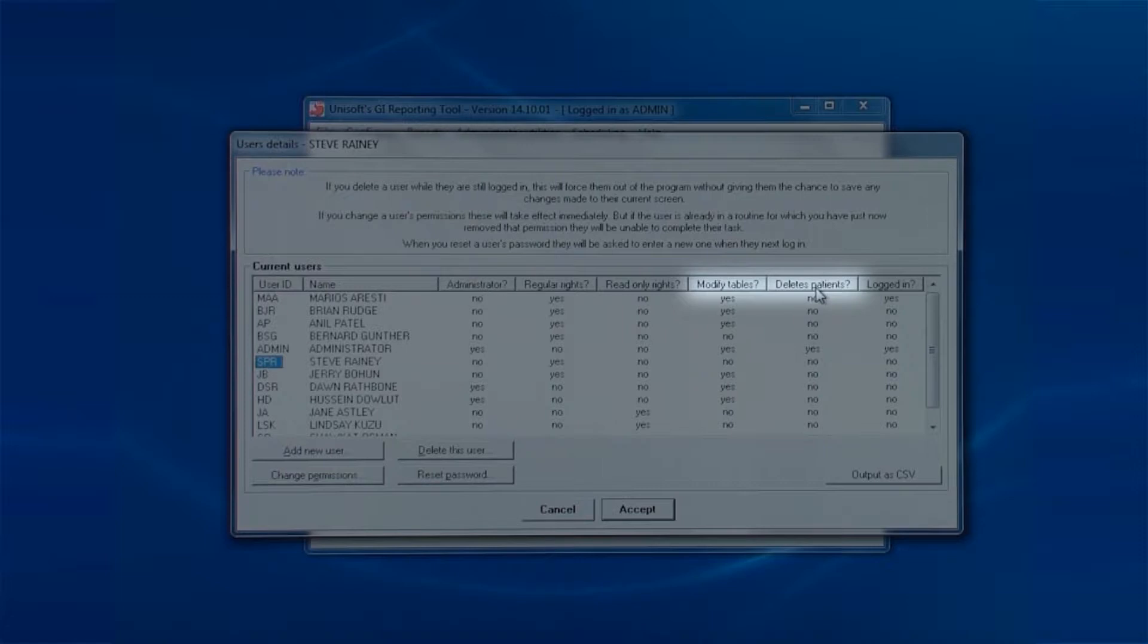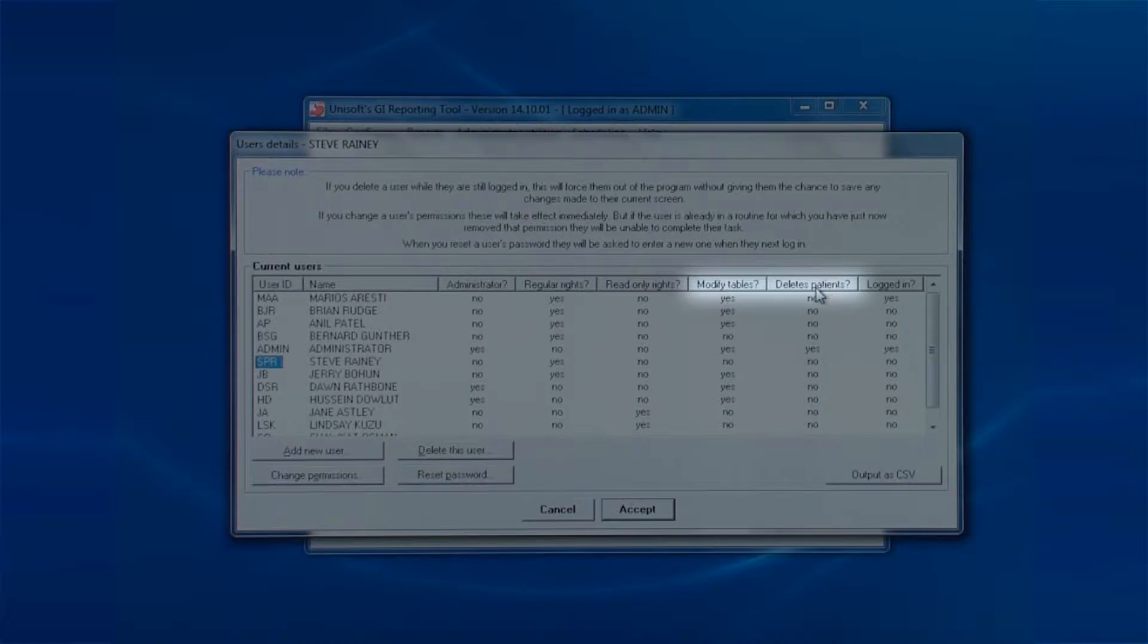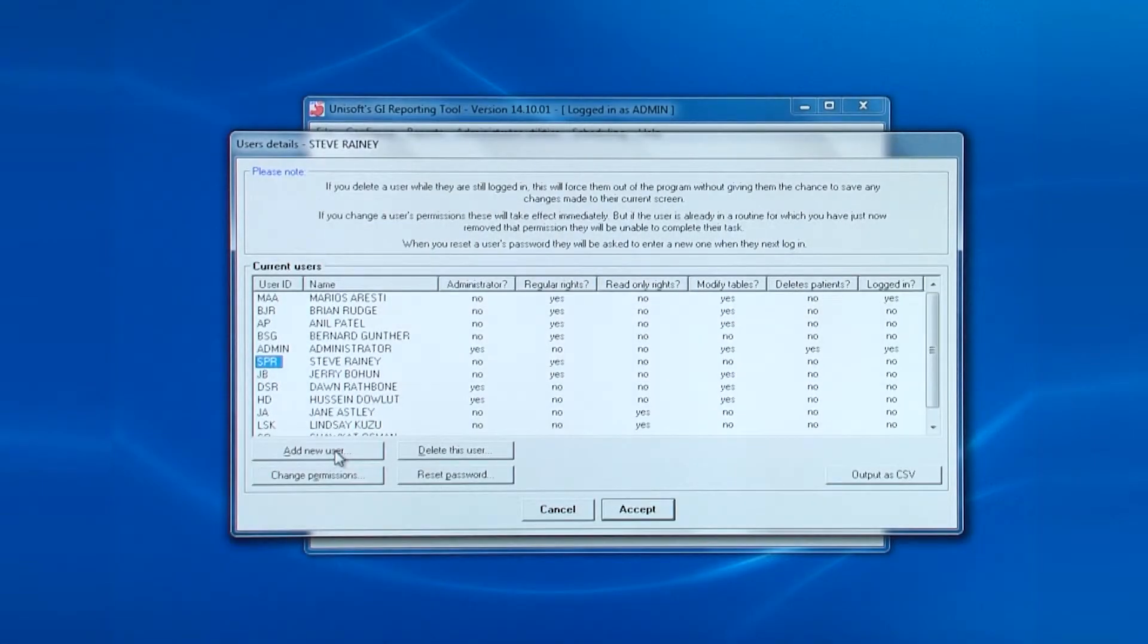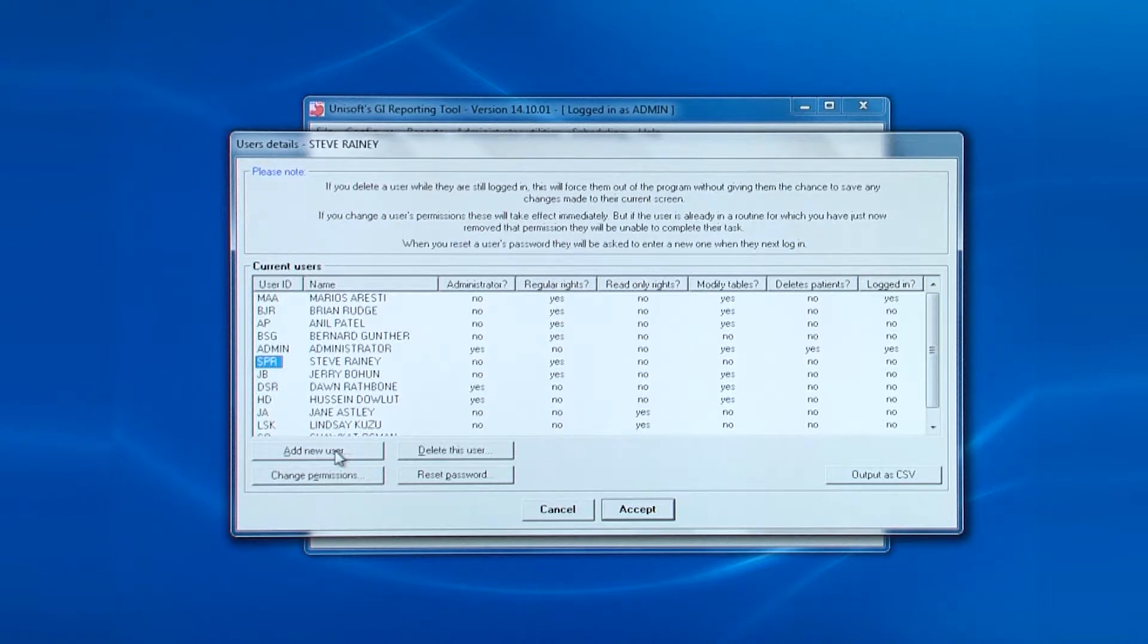The second item is important and cannot be changed unless you are logged in as admin. Those who are allowed to delete patients from the database can also delete patient reports. So for security reasons, the only person allowed to change these permissions is admin. No one else can. Finally, the rightmost column shows those currently logged in.